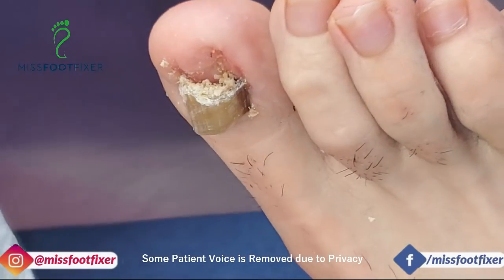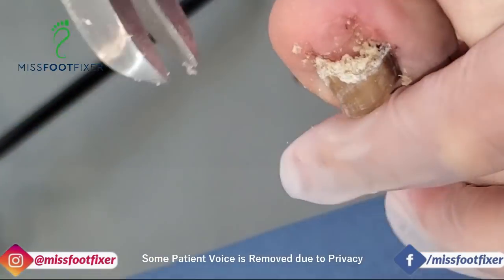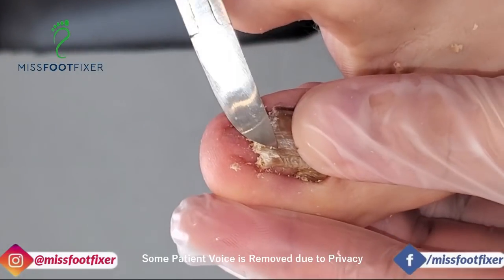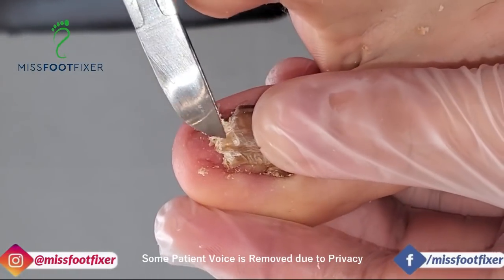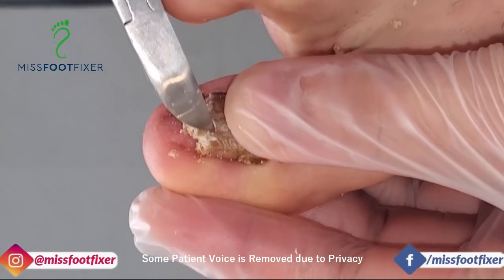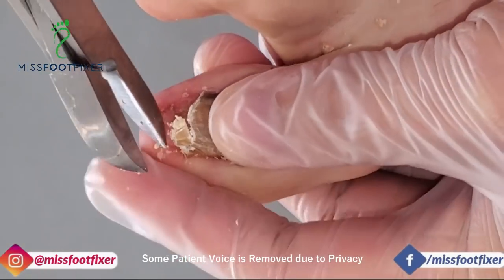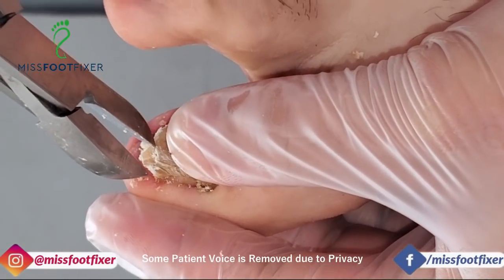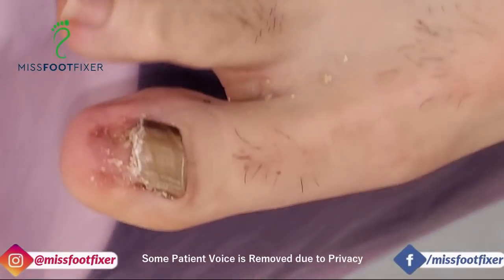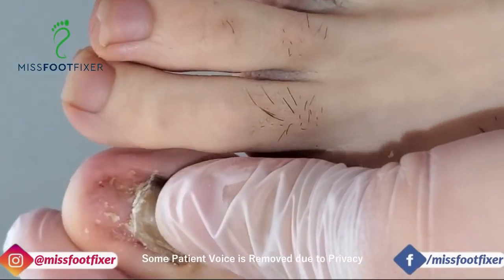Well done, excellent. Still a lot of debris underneath, isn't there? Same as before, just the other direction. Same. Yep, it's coming off. Excellent, look at that. Oh, massive chunk, beautiful. Beautiful, that's good. I think bevel, file, I think that's good.